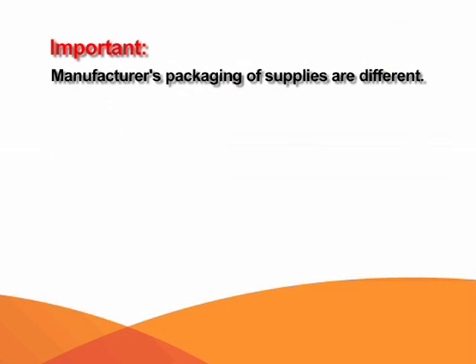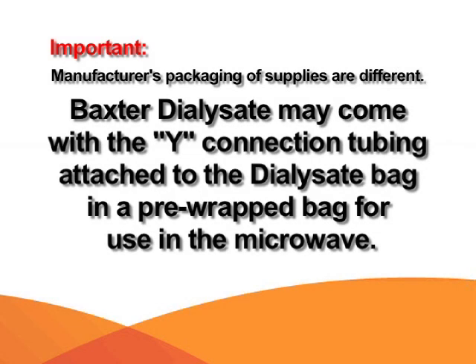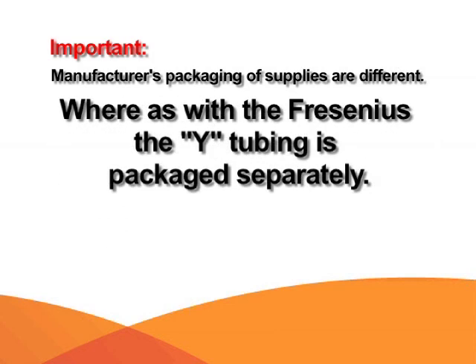What may be confusing is that the manufacturer's packaging of the supplies is different. For example, the Baxter dialysate solution may come with the Y-connection tubing already attached to the dialysate bag in a pre-wrapped bag, so all of this is warmed in the microwave together. Whereas with the Fresenius, the Y-tubing is packaged separately.